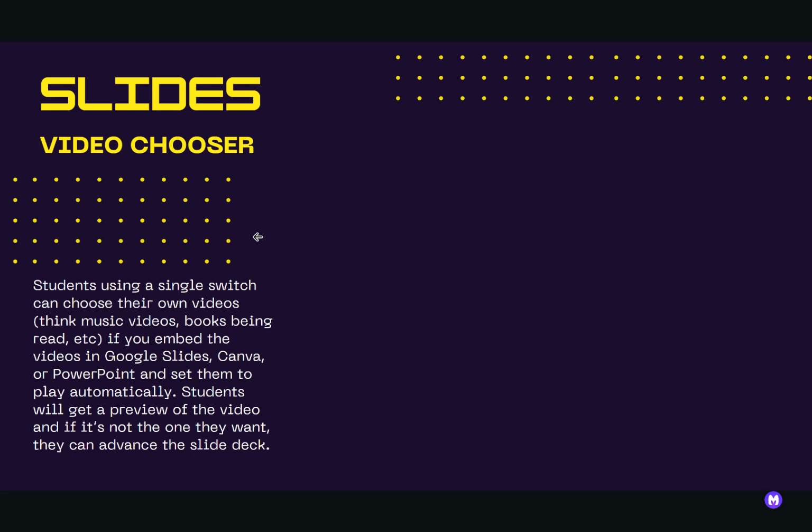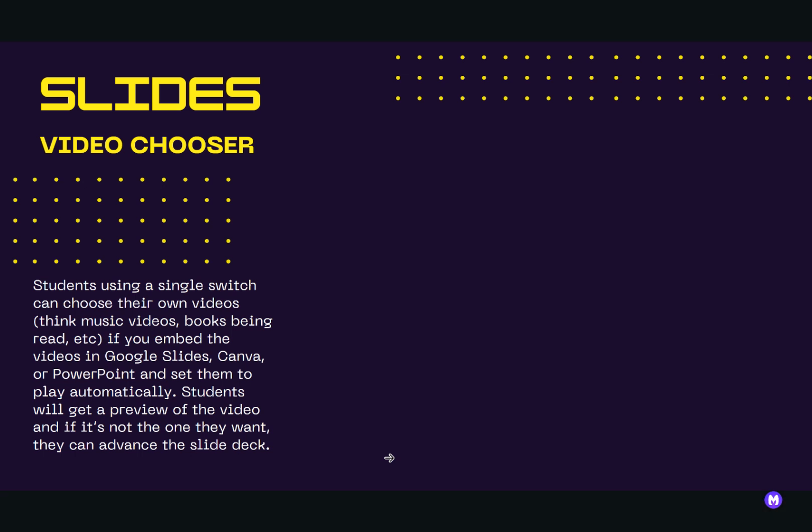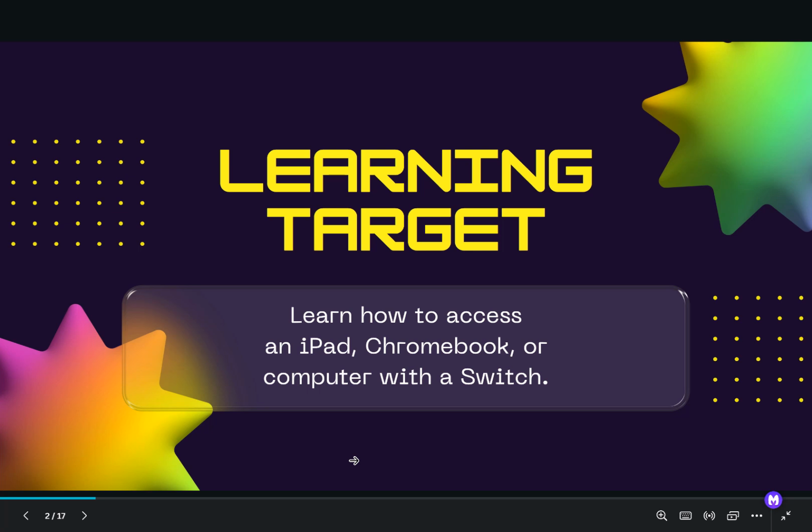So think about how you could create videos of you reading a book. You could grab videos from YouTube of music videos, those sorts of things. So go ahead and watch the video on this slide if you want to learn how to create a slide deck where your single switch users can choose the videos they want to watch. I hope that gives you a nice overview of how to use switches with the iPad, the Chromebook, or a computer.